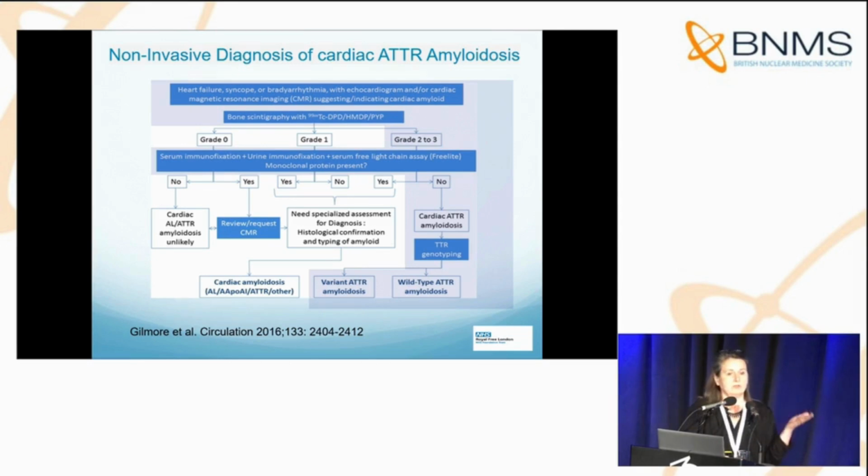But like I said, if the patient had had a plasma cell dyscrasia, you don't know whether this is AL amyloid causing the uptake, and we've got particularly strong DPD. Grade 3, we do see that in our AL patients. So the patient would have to have a biopsy.